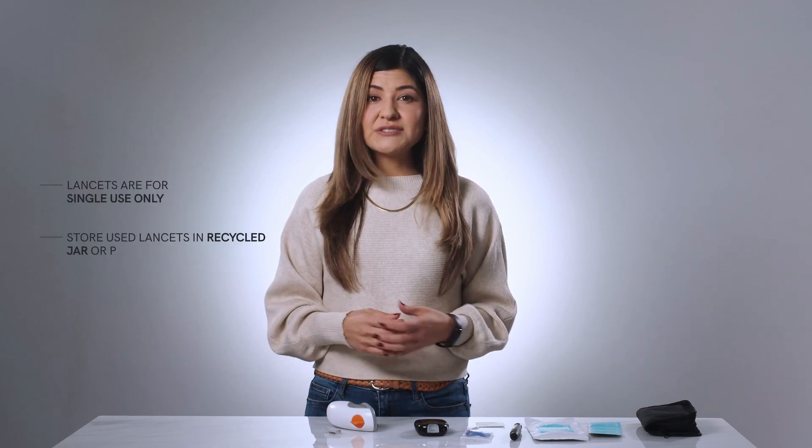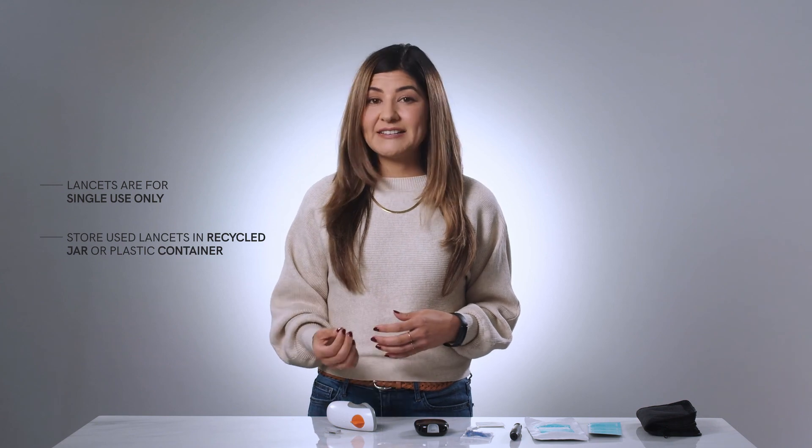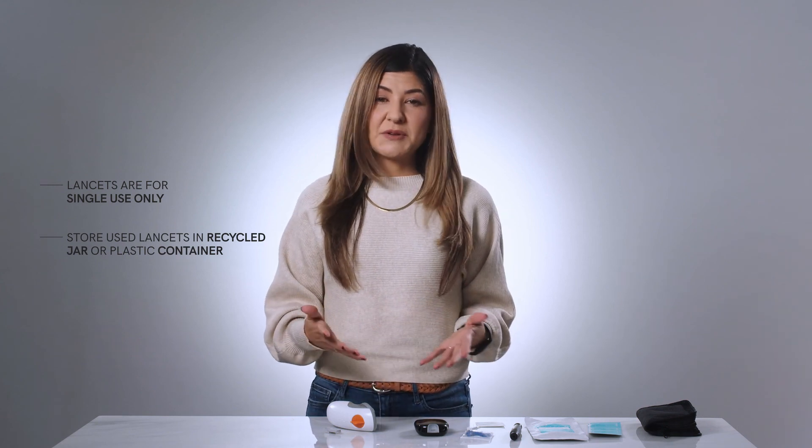If your ketone measurement hasn't been added to the Twin app after a short wait, enter your reading manually. Tap on Help in the Measure Ketones action card, then select Sync is Not Working Today and follow the instructions for manually entering your ketone reading. Lancets are for single use only — store your used lancets in a recycled jar or plastic container and when full, dispose of safely. When you're finished, store the ketone meter box and owner's manual in the Twin toolbox for safekeeping.